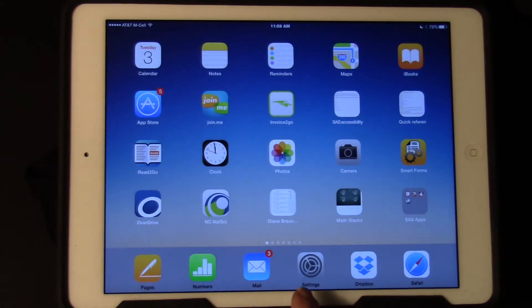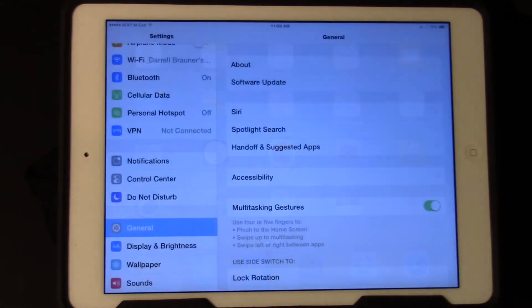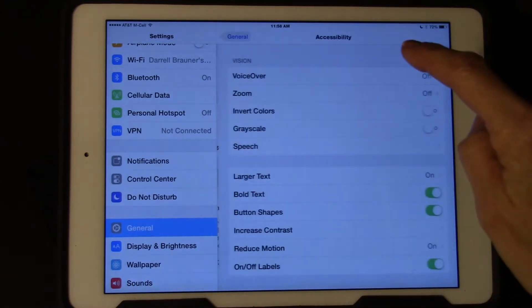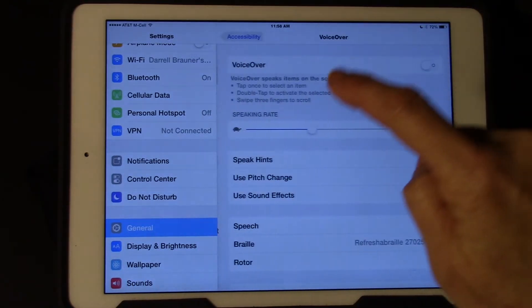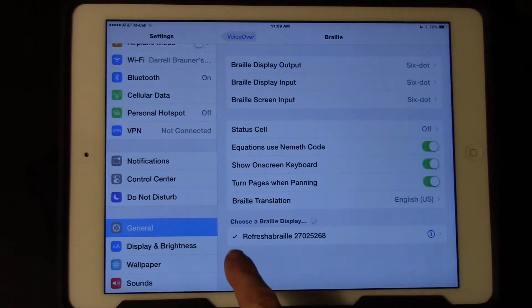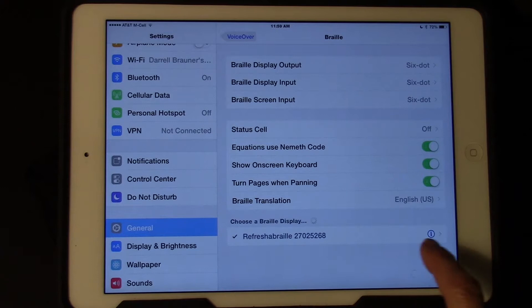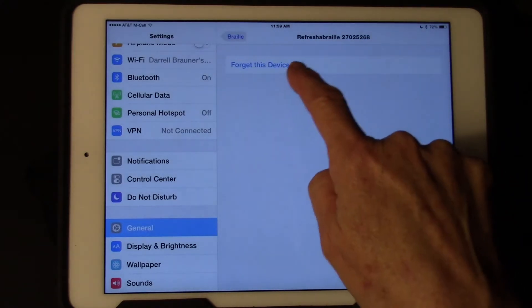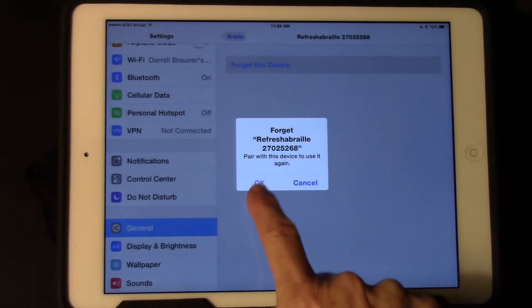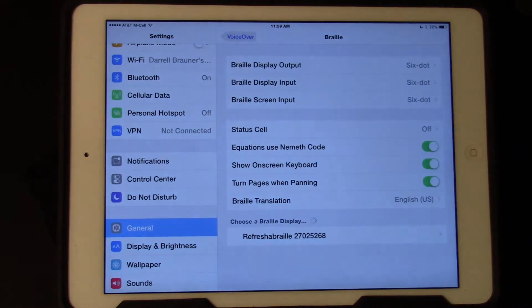To unpair the refreshable braille display, we're going to go to Settings, then General on the left-hand side, Accessibility on the right two-thirds, tap on VoiceOver, tap on Braille. There's my checked refreshable braille display. I'm going to tap the "i" for information on the right-hand side. It says "Forget This Device" — I'm going to tap on that and say OK. Now it's no longer checked, so I'm no longer paired.